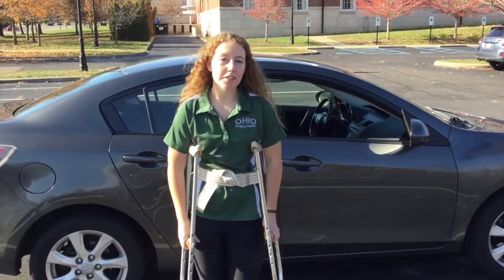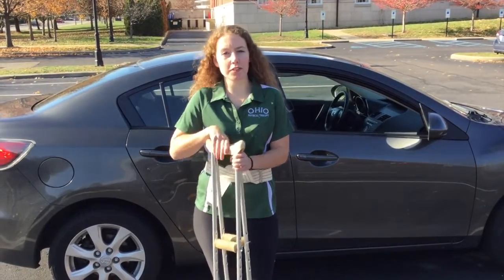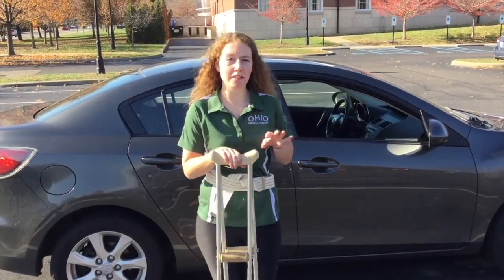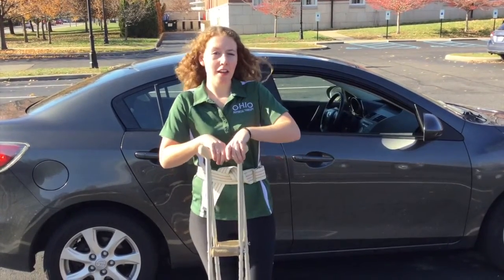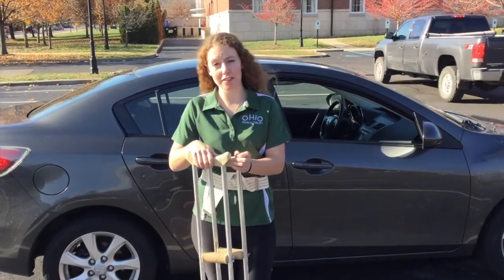And that's that. Okay, so if your patient is feeling unsteady on crutches or they're new to using crutches, you as a physical therapist can be there to guard them as they are walking towards the car and getting in. And you can refer to skill 30 for proper guarding techniques using crutches.